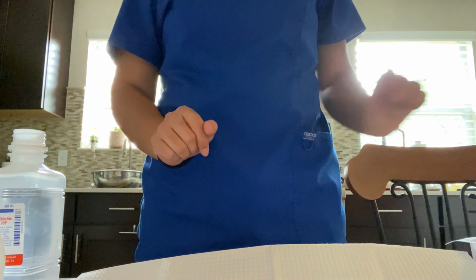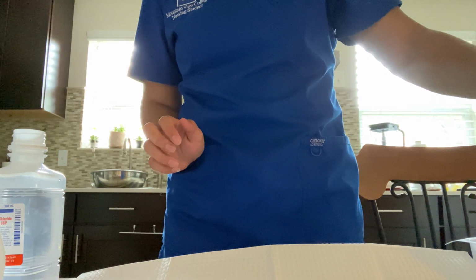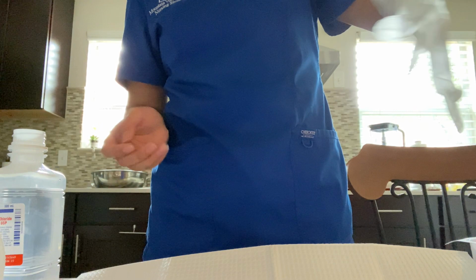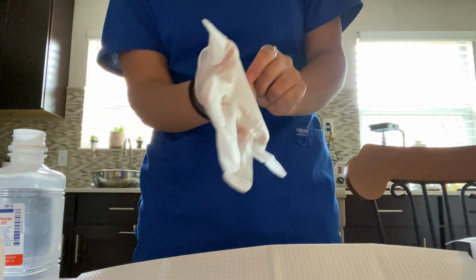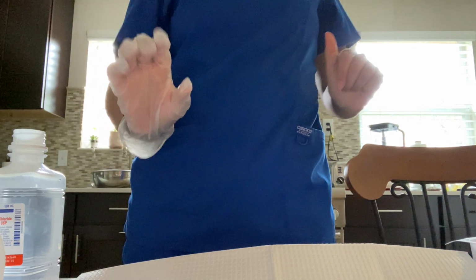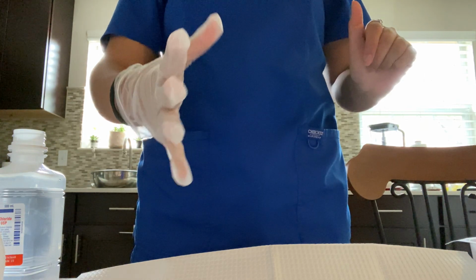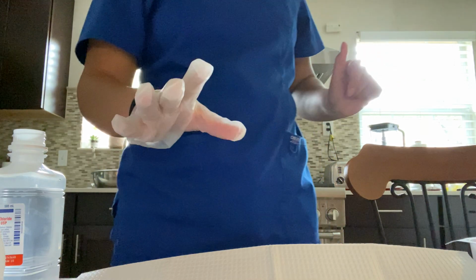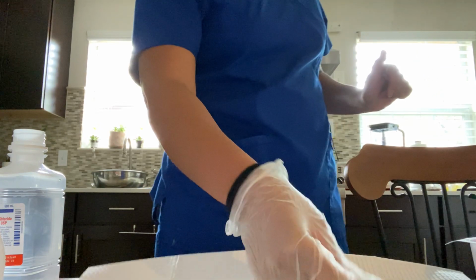I'm going to just put on one sterile glove. It'll be my right. So I'm just going to put it on. There we go. This is sterile. We're going to put on our sterile glove, which is my right hand. And I'm going to use this and move all the equipment in my little bag to my sterile field.